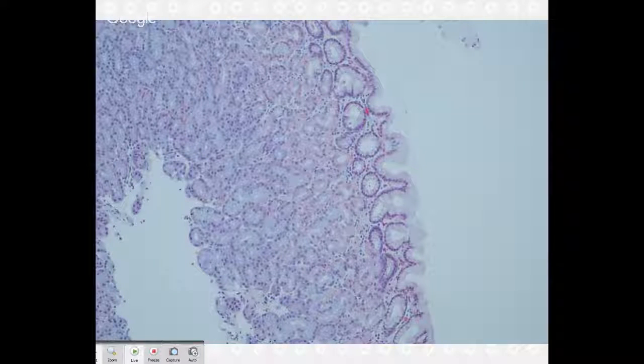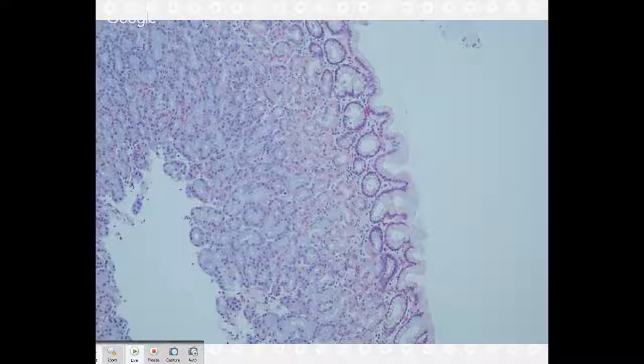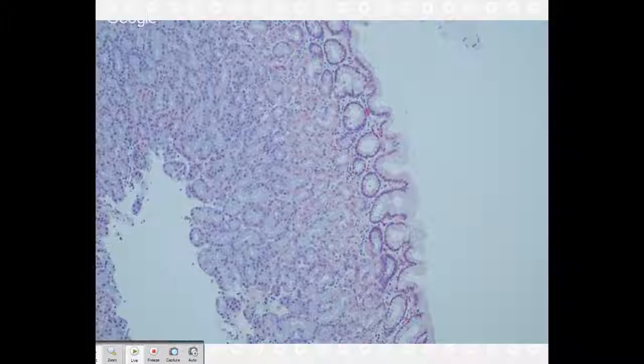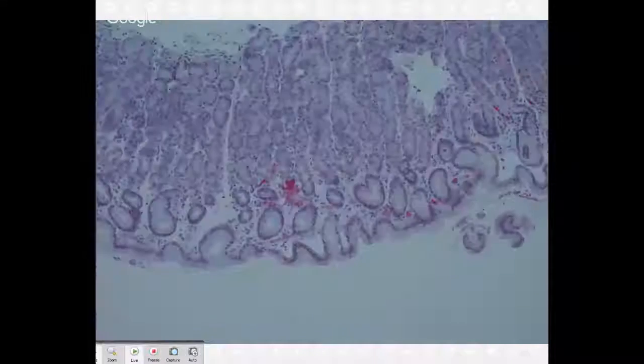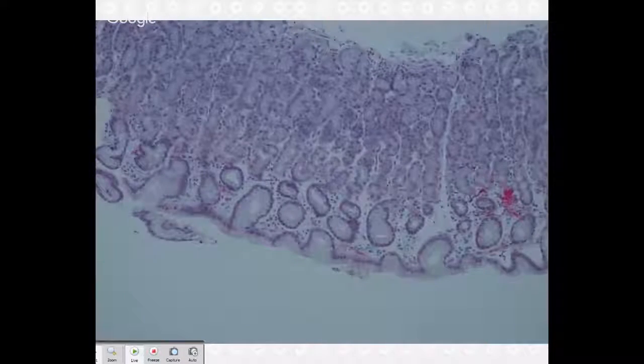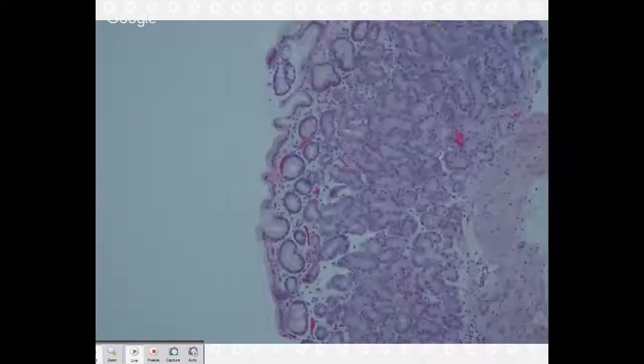So we have a gastric biopsy showing what looks like oxyntic mucosa. Right. Okay. This is oxyntic mucosa. I'm just going to help you and say this is normal. Now I'm going to move, and you tell me when it stops being normal. It's still normal. Okay. It's a little edematous, but yeah, okay, right? Like if you just had this biopsy, you'd be like, normal, next case. Good. Great.